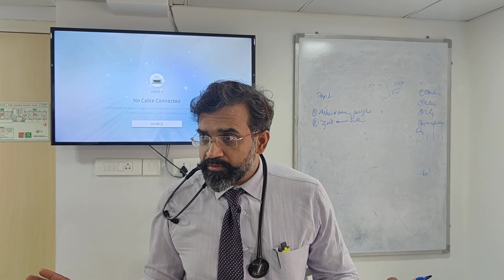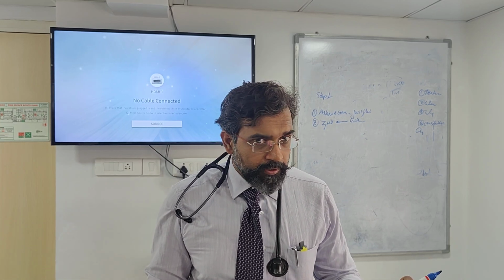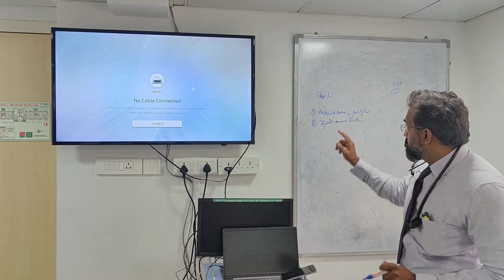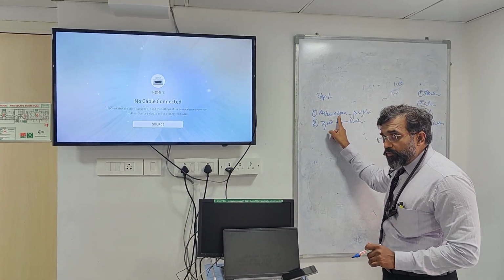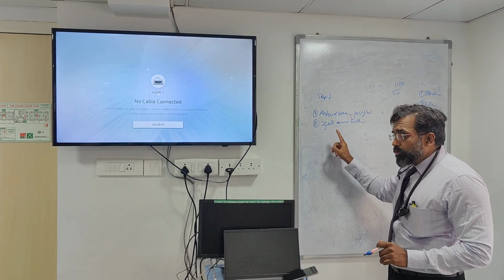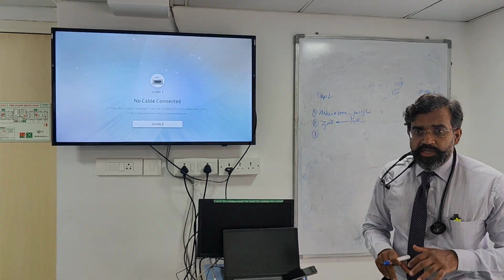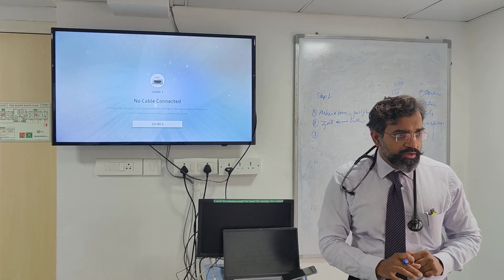Any doubts till now? Clear? This is step number 2. Step number 1 is the arterial trace; you are checking that the trace is okay. Step number 2 is zero. Step number 3, what is step number 3? It is verification of connections.